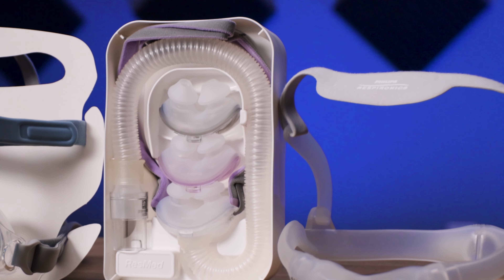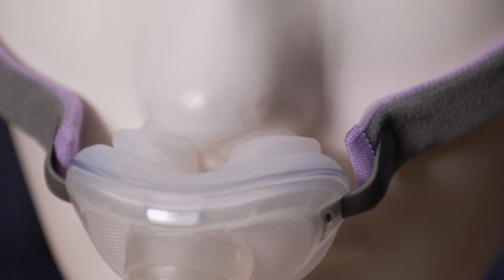Or perhaps you have a full face mask that used to seal perfectly when you were clean shaven, but since growing out that glorious beard of yours, you've noticed a drop off in the quality of your sleep. It could be that your facial hair is preventing the mask cushion from getting a good seal around your mouth like it used to. If that's the case, switching to a nasal pillow mask would solve that issue.